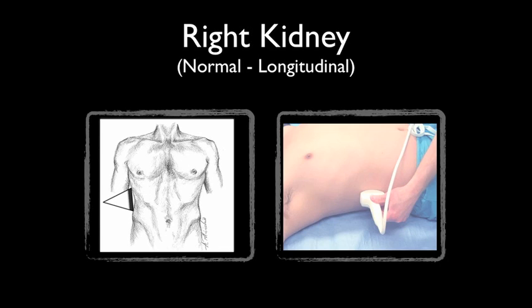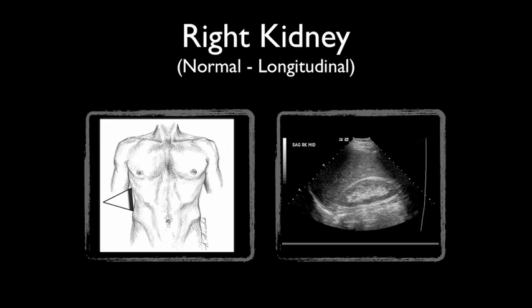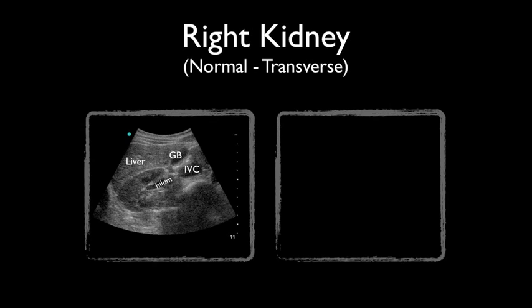Place the probe along the right mid-axillary line to find the longitudinal view of the right kidney. The kidney is football-shaped, usually between 9 and 12 centimeters in length and 4 to 5 centimeters in width. Notice the hyperechoic diaphragm on the left side of the screen and the liver above. The transverse view of the kidney appears C-shaped. The bright area around the kidney is Gerota's fascia and perinephric fat. These are normal findings.